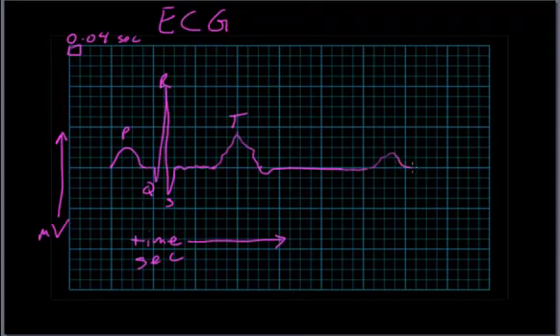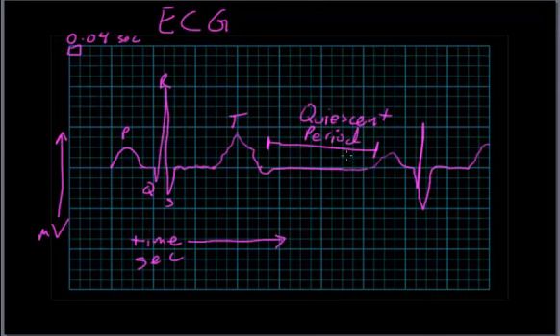1, 2, 3, which would be something like that, and then QRS, and again, sorry for the poor drawing quality, but you get the idea. This period between heartbeats is what we refer to as the quiescent period. And this is the time when there are no action potentials being generated in the myocardium of the heart. It's essentially the space between heartbeats. So these are the basic waveforms.